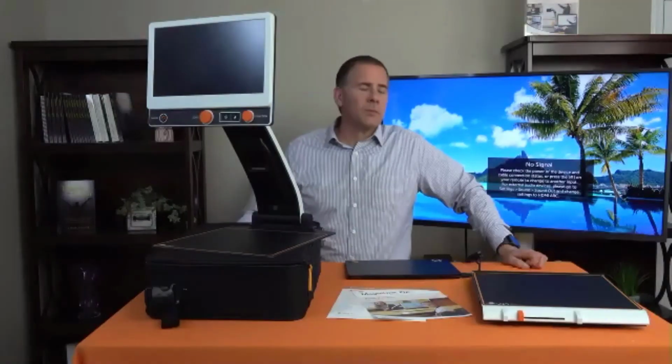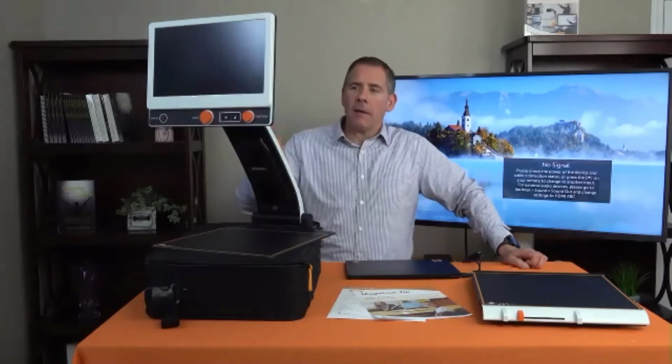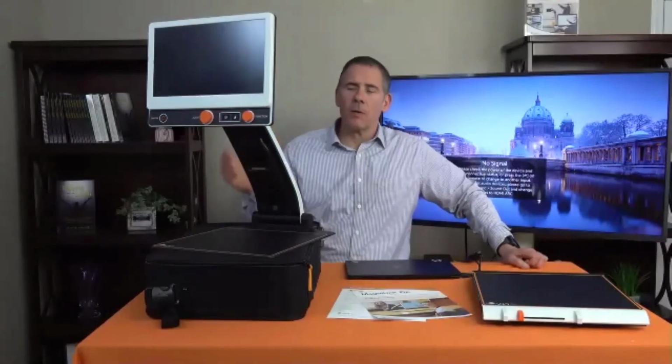I just want to mention the reason the battery needs to be ordered ahead of time. It's a different board that goes into the unit once the battery is in here. So the board is a little different because of power delivery and power saving. The one that's just an accessory, AC plug, doesn't have that board in it. It has a different board. So that's why we have to order it up front.